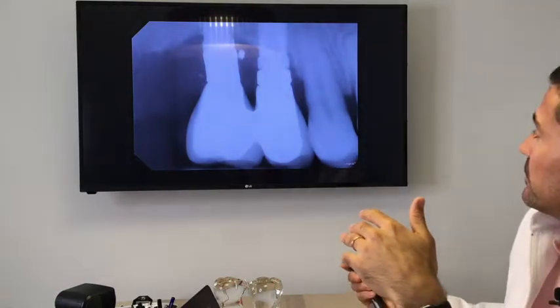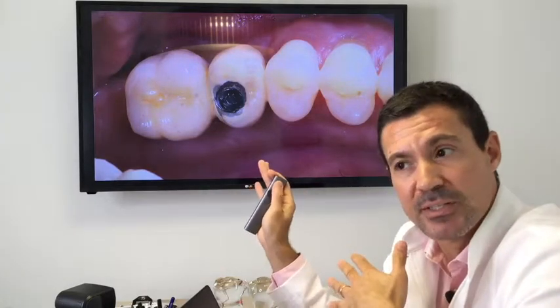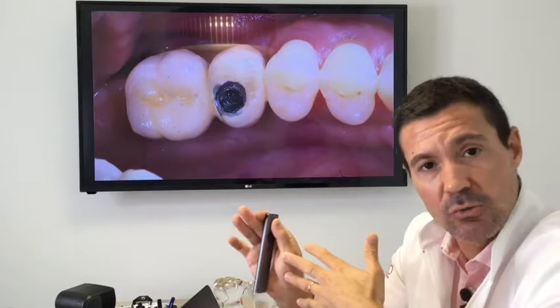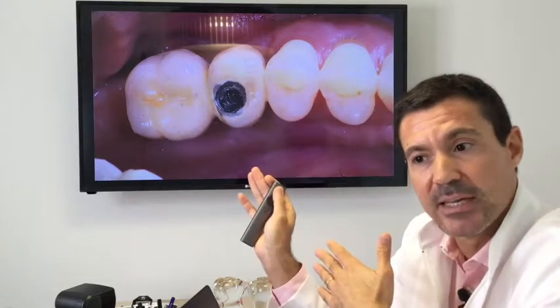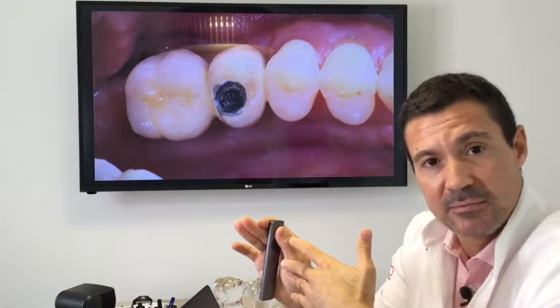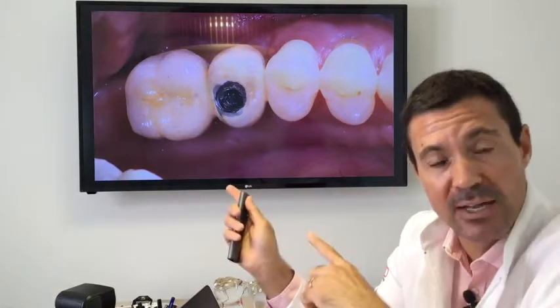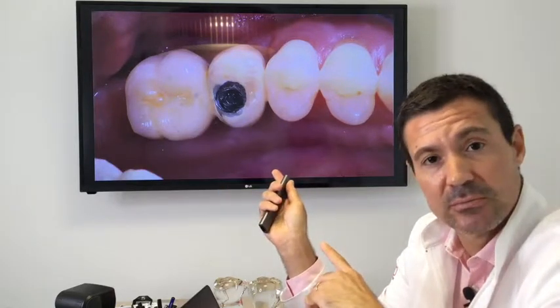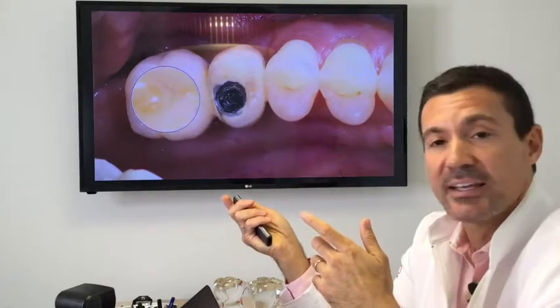So we access the second premolar by drilling through the crown, and we found the screw. We found the screw, we re-screwed the area, we re-screwed the crown, and we told the patient, now it's not moving, but probably, since the full structure was moving before, I need to go to the molar as well and do the same thing. We were successful because we actually found the screw. But the patient didn't want to go to the second screw because the patient was feeling that everything was stable.